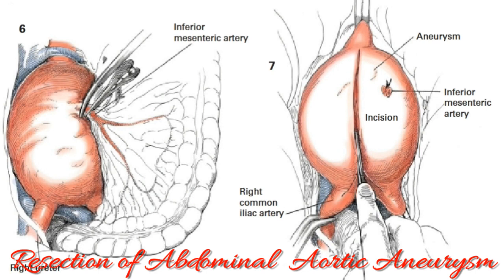The common iliac arteries are then exposed on their anterior, lateral, and medial surfaces in preparation for clamp placement. It is not necessary to encircle these vessels completely, as dissection posteriorly can result in troublesome hemorrhage from the underlying iliac vein. During iliac artery exposure, the ureters are identified and protected from injury throughout the procedure. Certain grafts previously required pre-clotting; however, this is not necessary with woven grafts, knitted grafts sealed with collagen or gelatin, or expanded polytetrafluoroethylene grafts. Heparin is then injected systemically or directly into the aneurysm to provide protective anticoagulation for the extremities during aortic clamping.